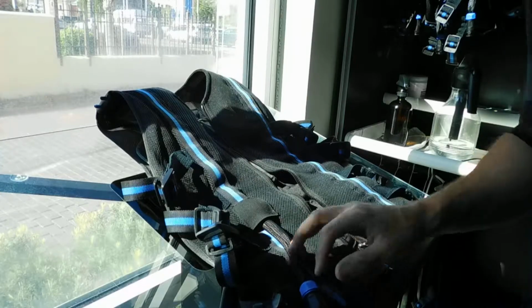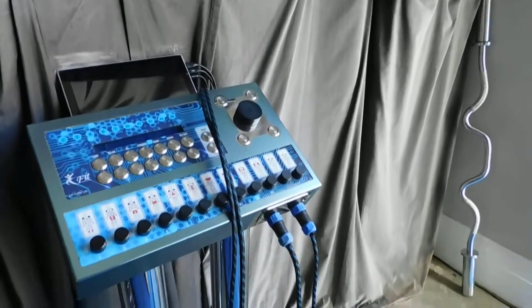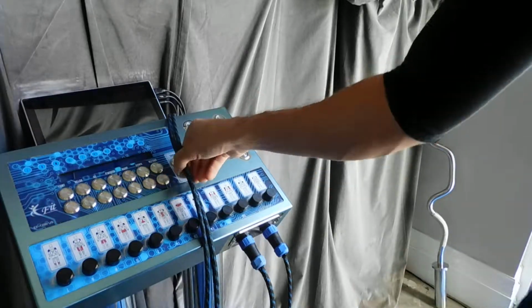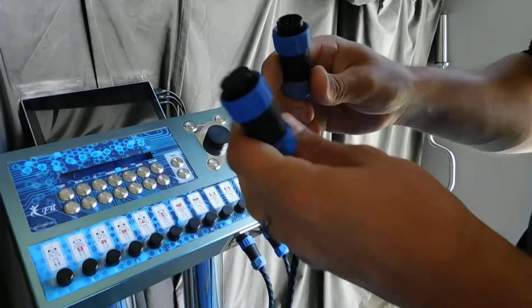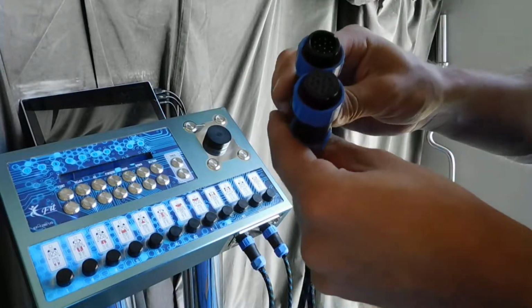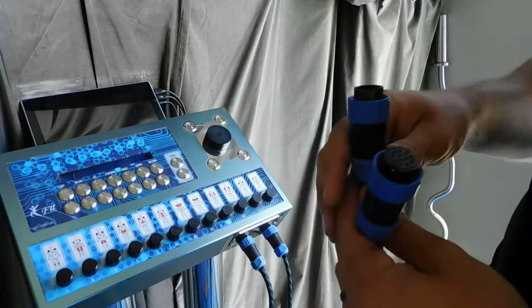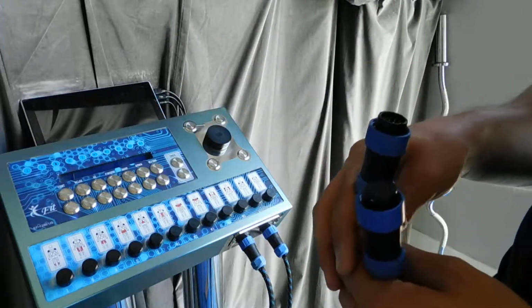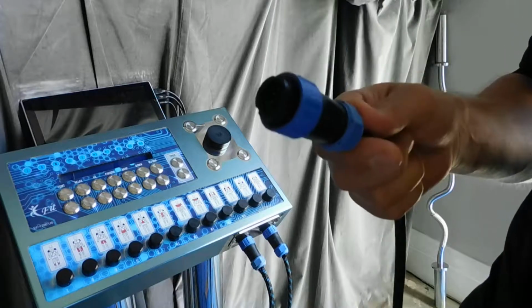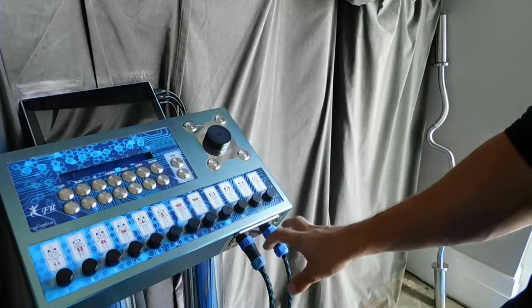So then what you need to do is, you come over here to the machine, and let me set this up. So with the machine, when it's right here, it might be the main cable, right? So what you need to do is, it's male and female. So one of them is the top, one of them is the vest right now. So if every single jacket, the abs are cutting out, then it's more than likely the main cable, right? So you would have to change this. But to confirm if it's the main cable, what you should do is switch it. So these two, just switch them up.